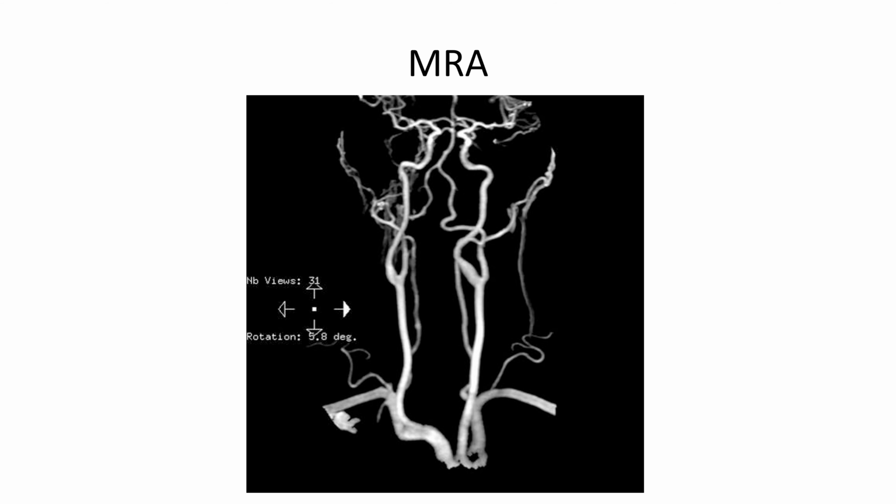And on this same patient, if you do an MR of the vessels, you can get an MR angiogram, an MRA, and this is what it looks like. You can see here that this is very fine resolution. This can actually be rotated in three-dimensional space, and it will show up as a very high-resolution image of the vessels with a nice subtraction of all the other tissues. So much better image than a CT angiogram.